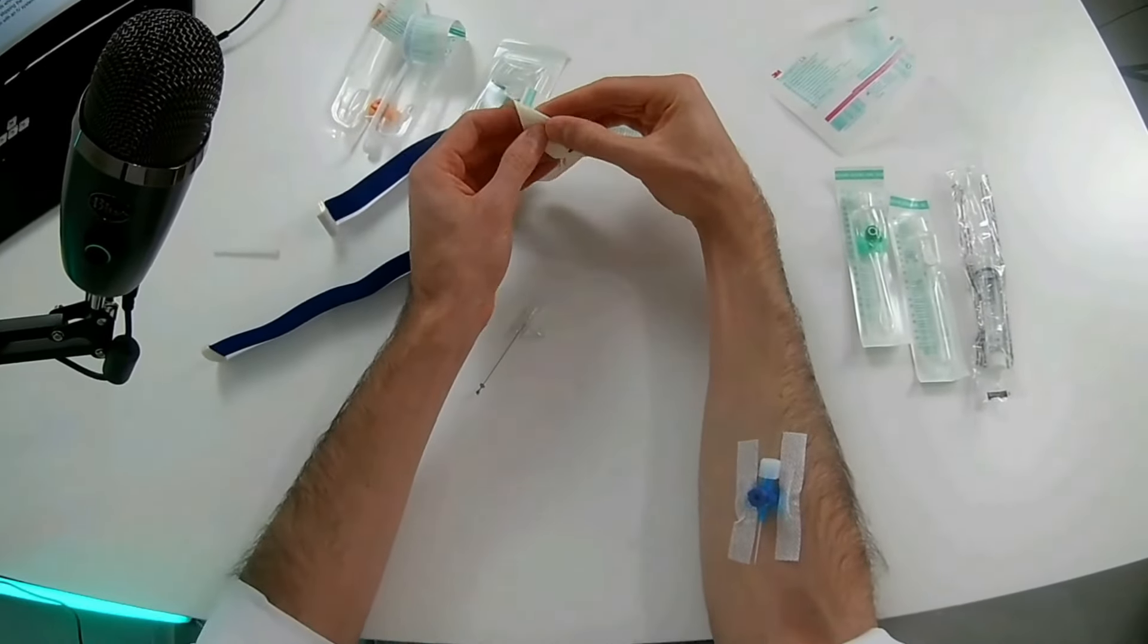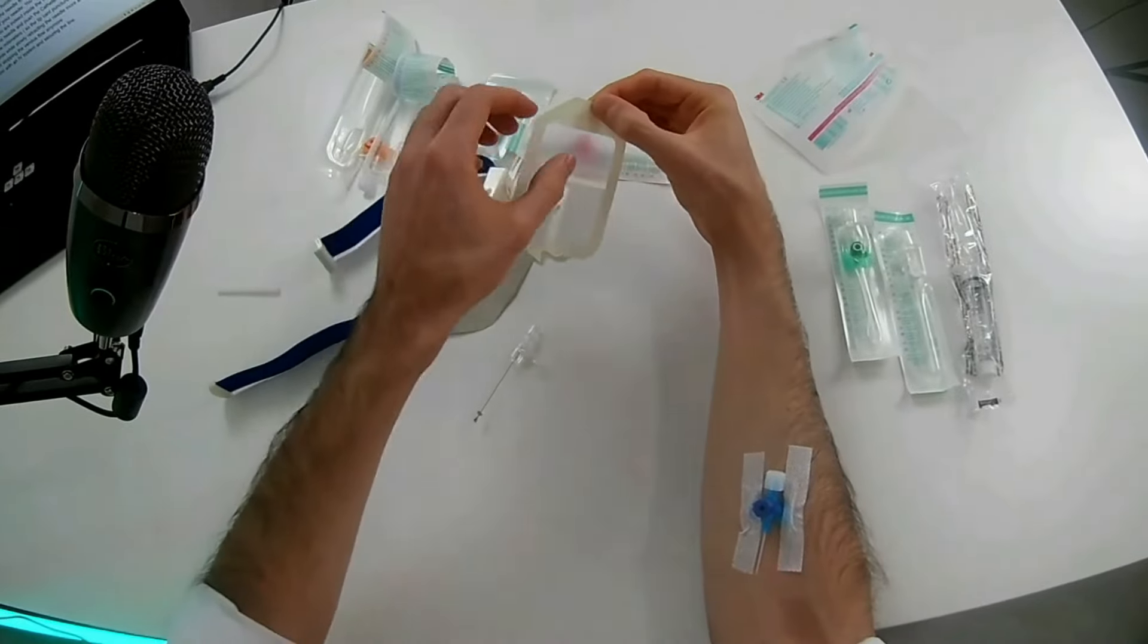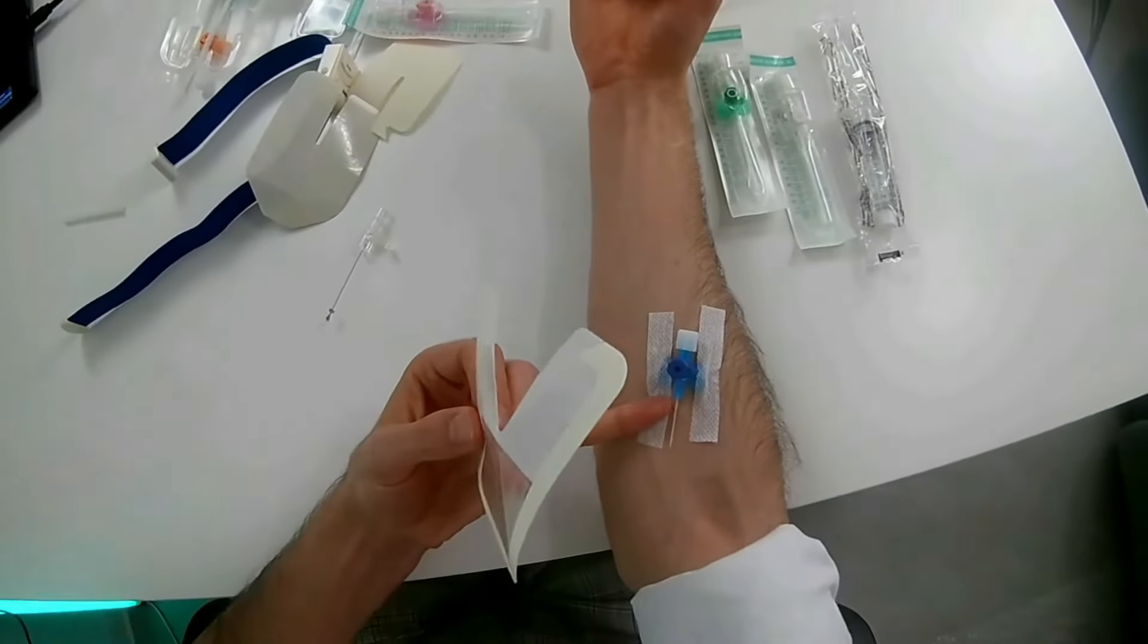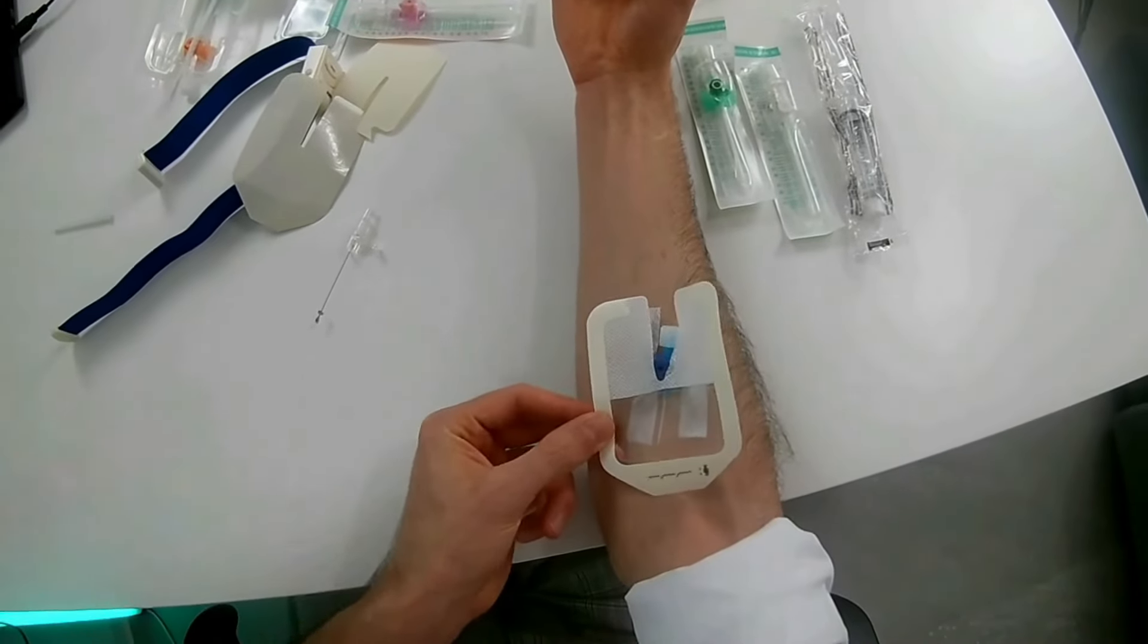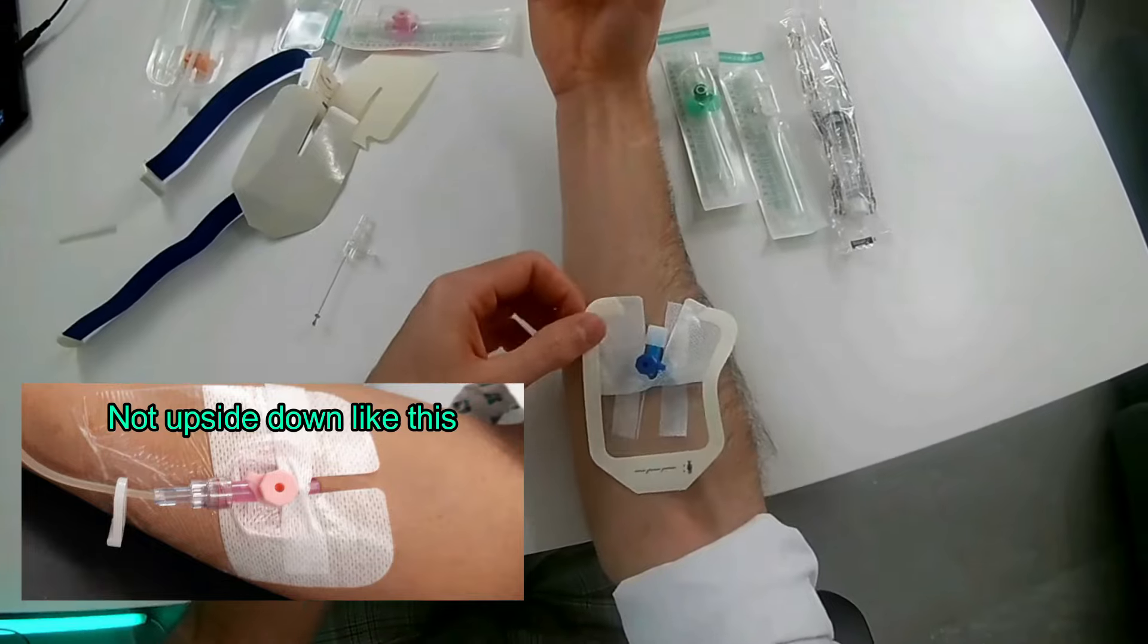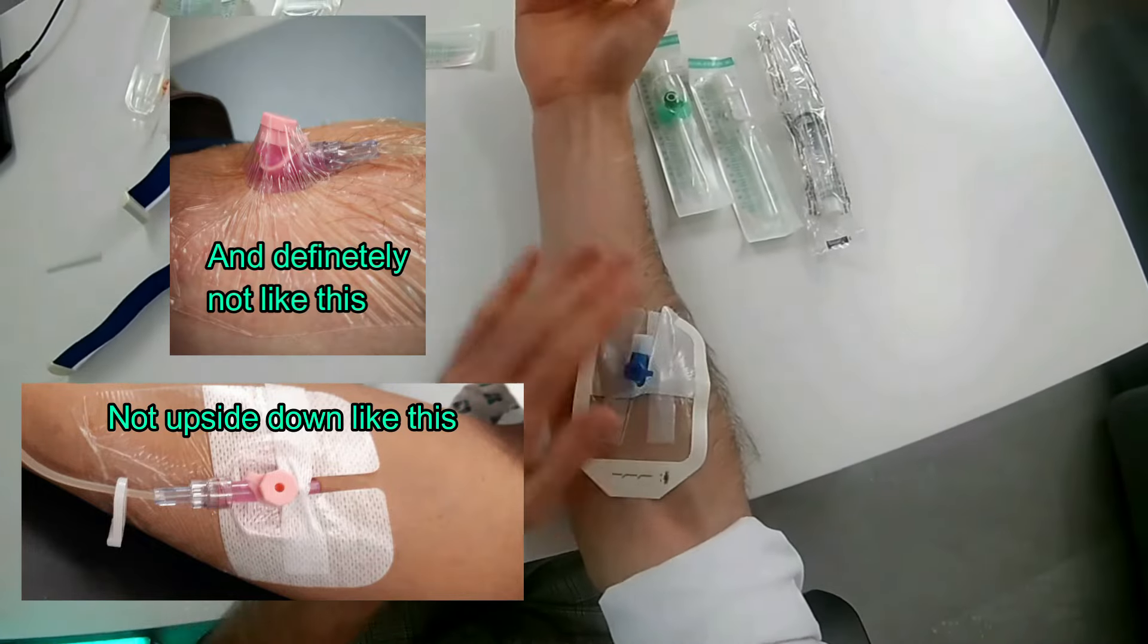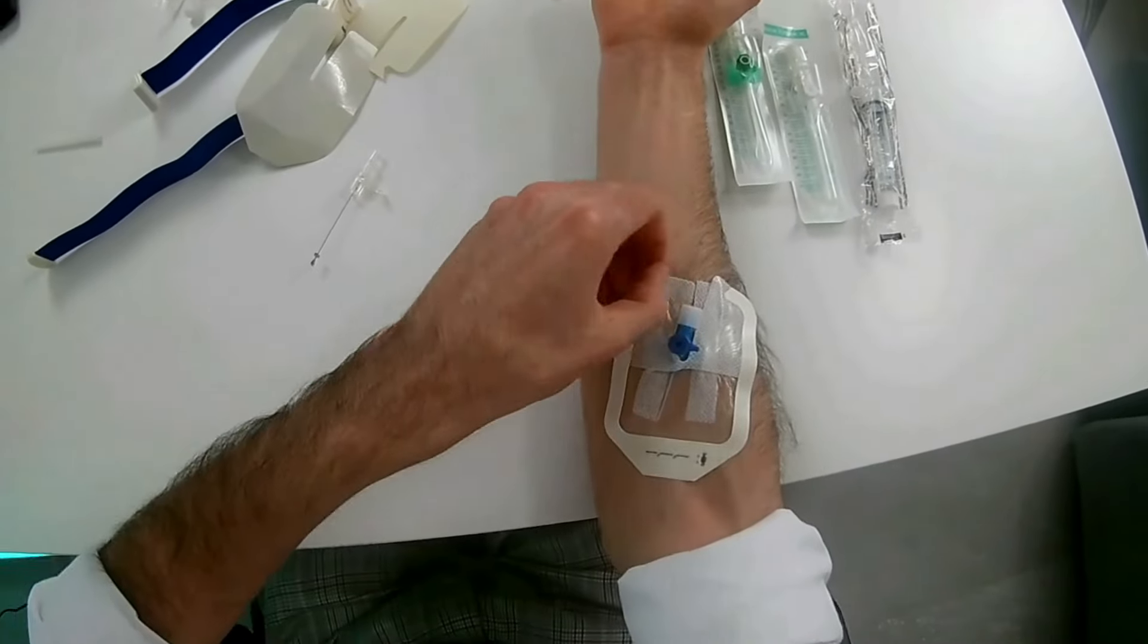Now very important, don't get this one wrong because all of the people who start doing them put them in the wrong way. Normally you wouldn't see the catheter, it would be inside of the vein, and you put this part like this, but better because you would have two hands to do it.